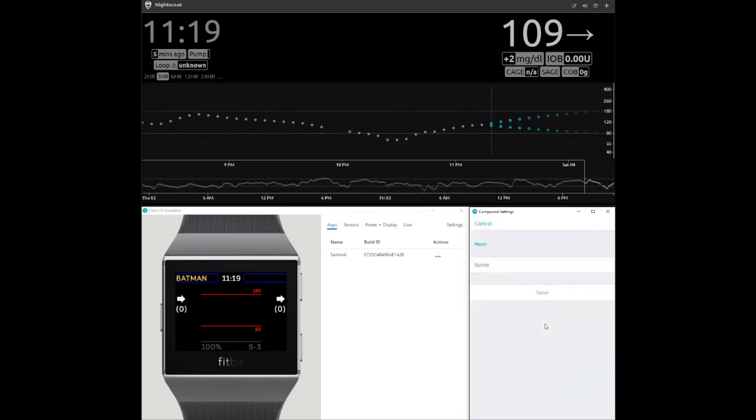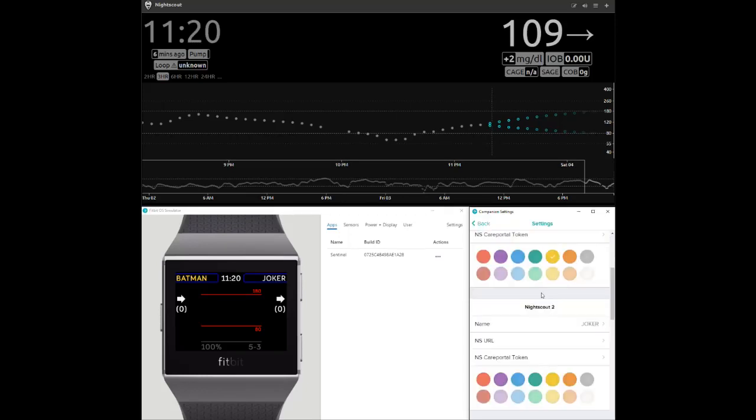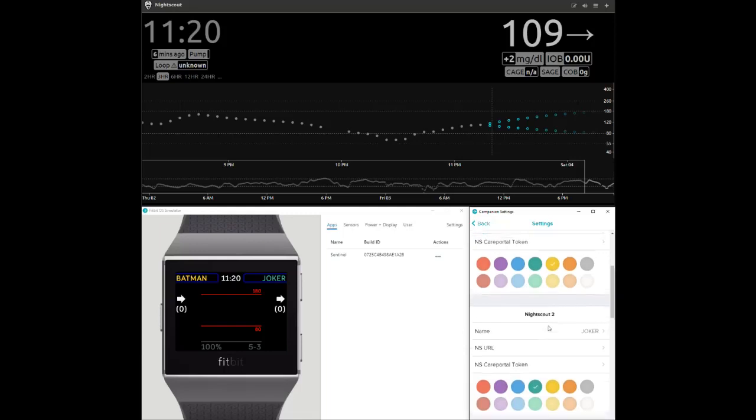The Sentinel Clockface allows users to associate a name with a NightScout account so that when alarms are triggered, the name of the person associated with the alarm is clearly indicated.